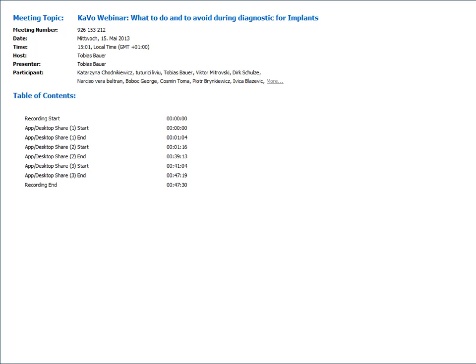And the second question was, in the case of sclerotic bone, would you recommend in favor of or against implant placement? In case of sclerotic bone, I think this is not a big problem, because sclerotic changes are only a reaction to inflammation.